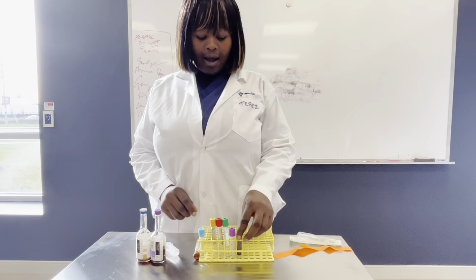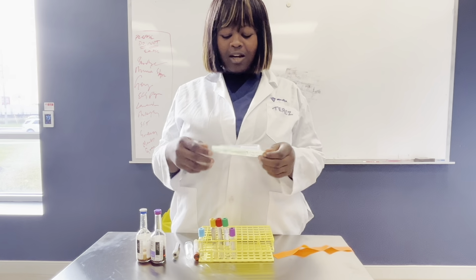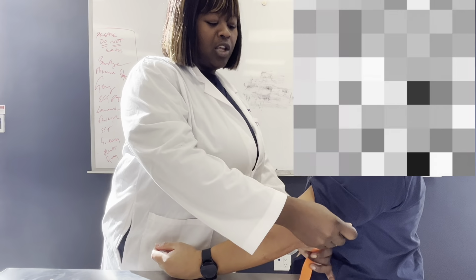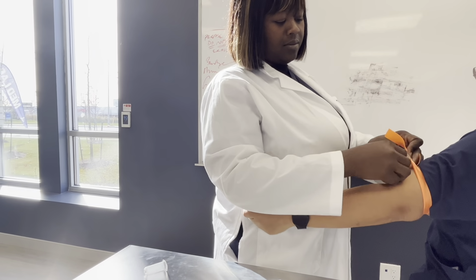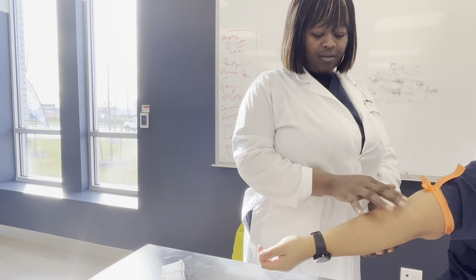So don't forget, after you're done drawing the blood, let me do a small demonstration of how we use these tubes, if you didn't already know. Firstly, you put on the tourniquet. Put the tourniquet on your patient. Okay. Make sure that it's nice and tight. Very good. You feel for the vein.